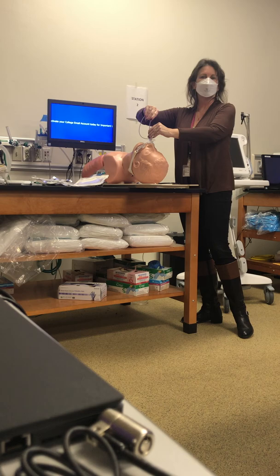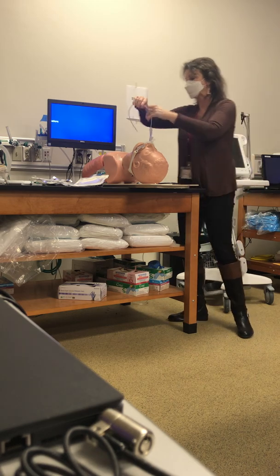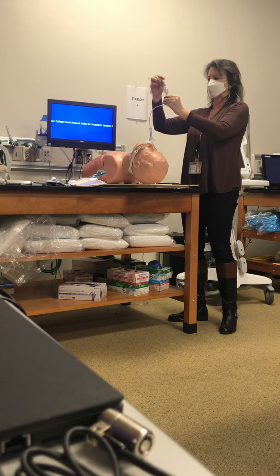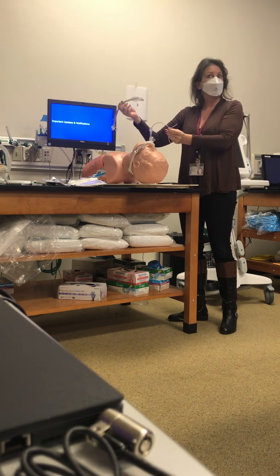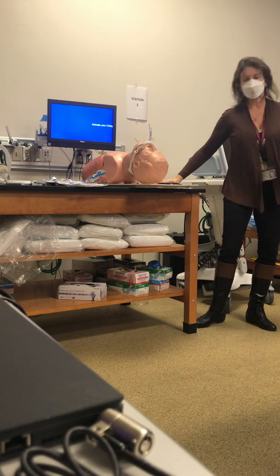They keep this in, but pull the tube out, so now they just have this sitting in the trachea. Now they can take another endotracheal tube and feed it through here, and it'll slide right in because it's got a path. So you're not losing your airway 100%. You still have a tube in. That's pretty cool.